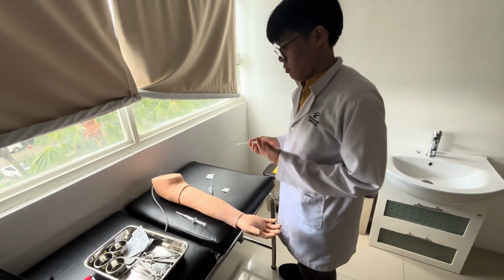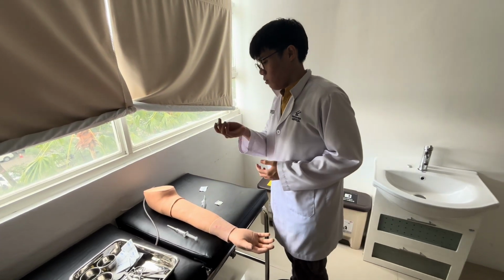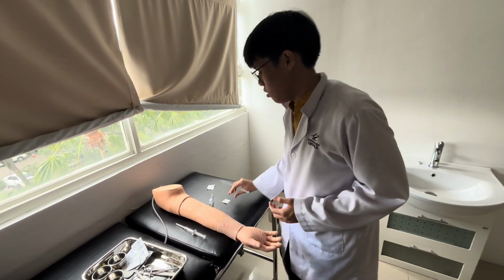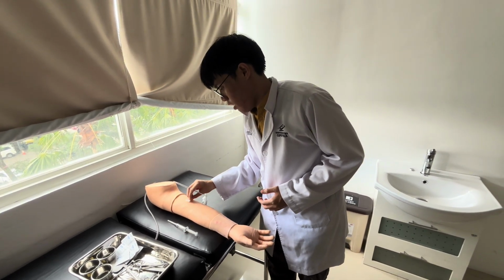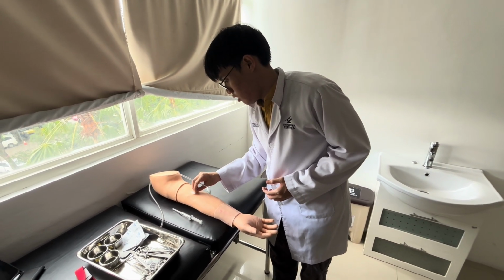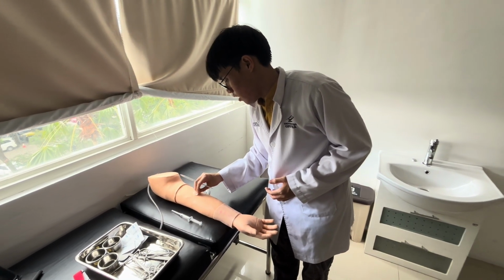Okay, so next up we will conduct subcutaneous. So let's assume the medicine's already in the syringe. So first what we'll do is use an alcohol swab on the area that we will inject. So let's say around here for now. And then remove it.